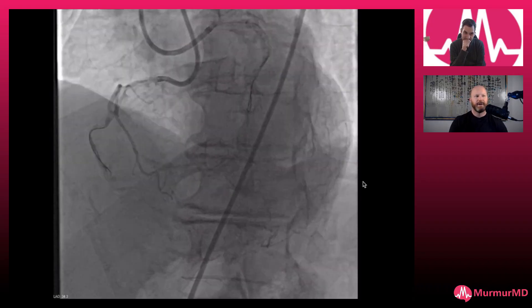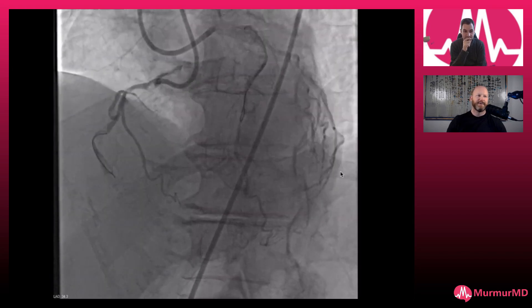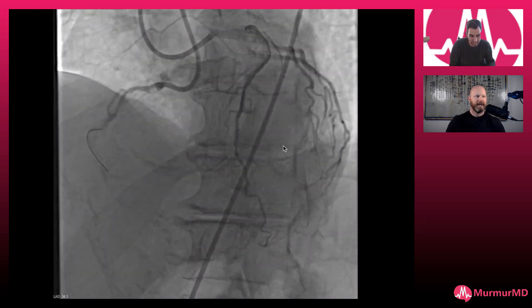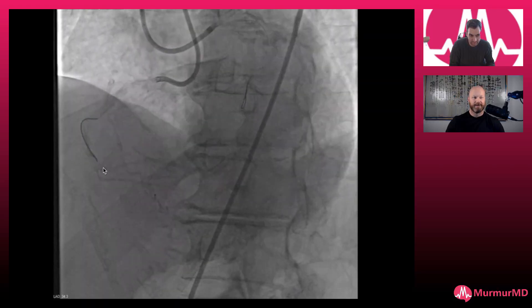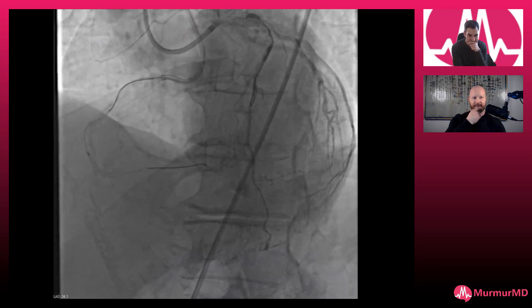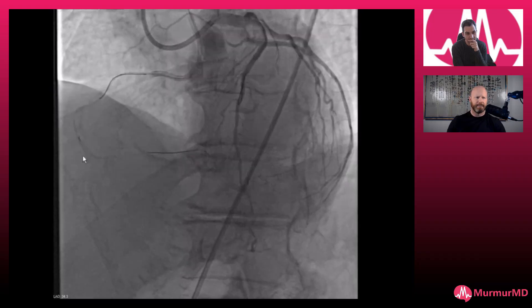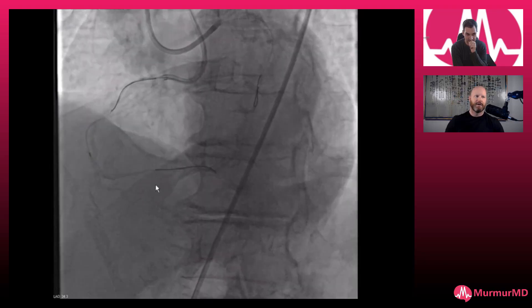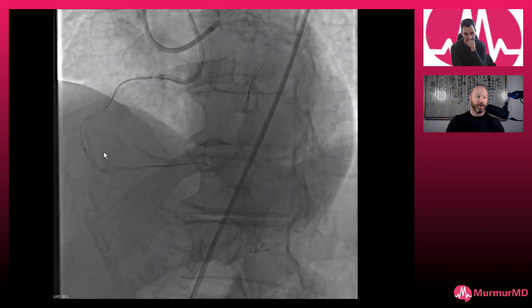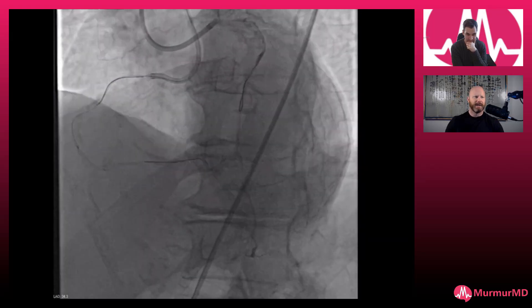I'll show you what we ended up doing and see what you think. I always have a hard time deciding how to modify this calcium when we get across — that obviously assumes we're going to get across. We have this pretty calcified right coronary CTO; can't see the outflow that well, it's kind of hazy down here. It almost looks like there might be competitive flow or some sort of micro channel. I was able to put my wire — I think it's probably Sion Black — and it got pretty far. I'm pretty close to the cap at a minimum and there might be a way to keep going. I took my microcatheter, gave myself some support, put a safety wire next to myself, and was able to escalate to a Gladius Mongo or a Pilot 200 — I forget which one. I was able to select what's probably an intraplaque course, which always gives me pause because I think, well, if I had gone around all this stuff I would have gotten an eccentric-looking stent and wouldn't have had to figure out how to modify this. But I don't know for sure that I'm extraplaque or intraplaque yet — I think based on how the wire crossed, I'm probably intraplaque. So now I'm in a position of, well, what do I do?